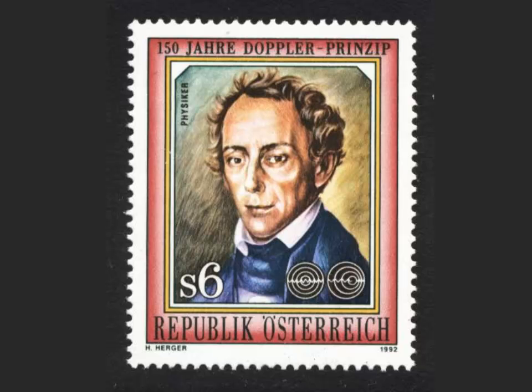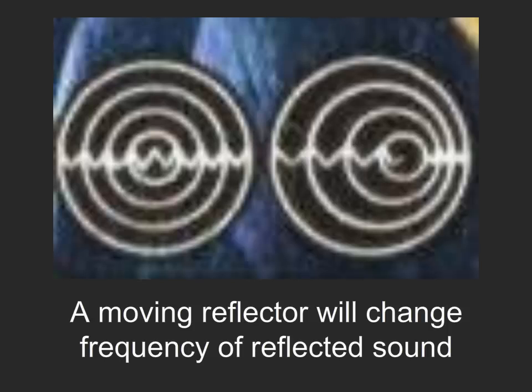Now for a little bit of flow measurement principles. Christian Doppler wrote his thesis on the apparent change in the color of light emitted by binary stars that rotate around each other. He never thought his name would be imprinted on every ultrasound machine in hospitals in the future. Otherwise, he would have trademarked his name.